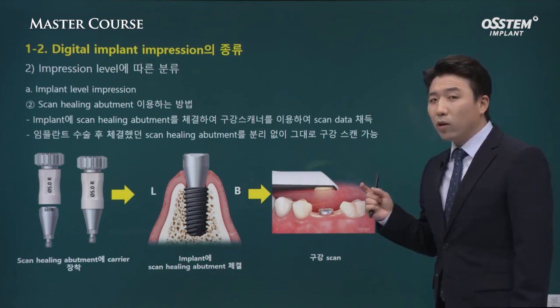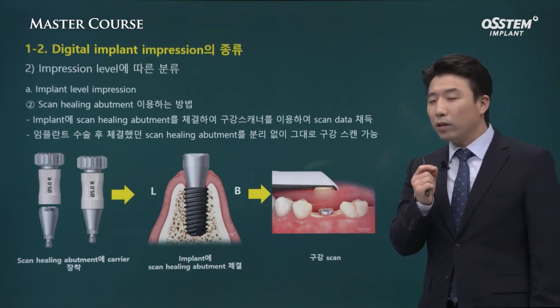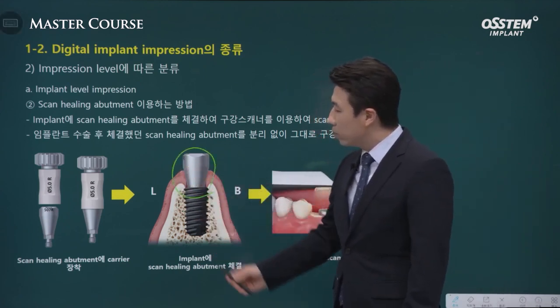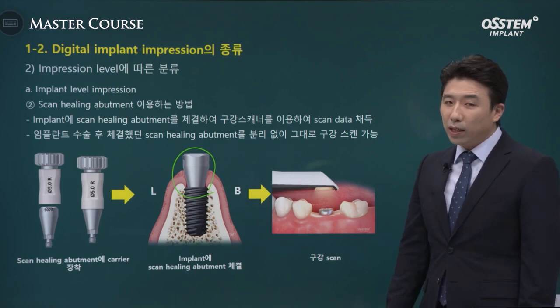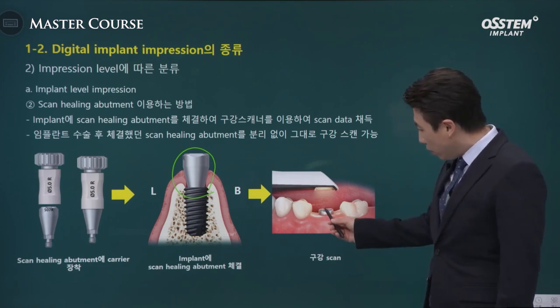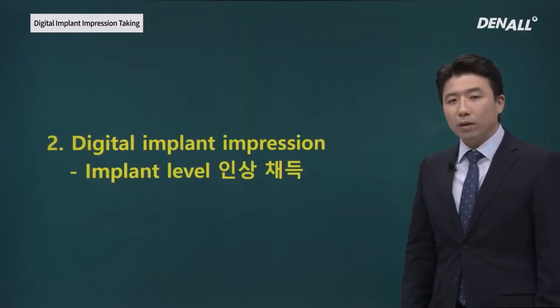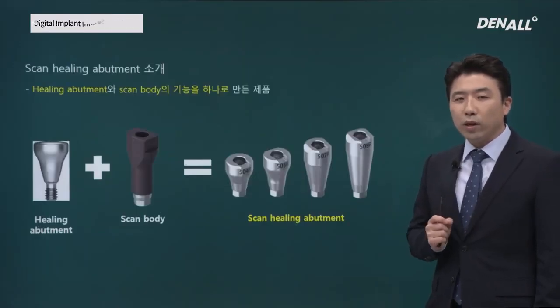Scan healing abutment is to be introduced here. It is not much different from a healing abutment, but if you look here, the top part has various information in the component to estimate the implant positions. Let me go into details.